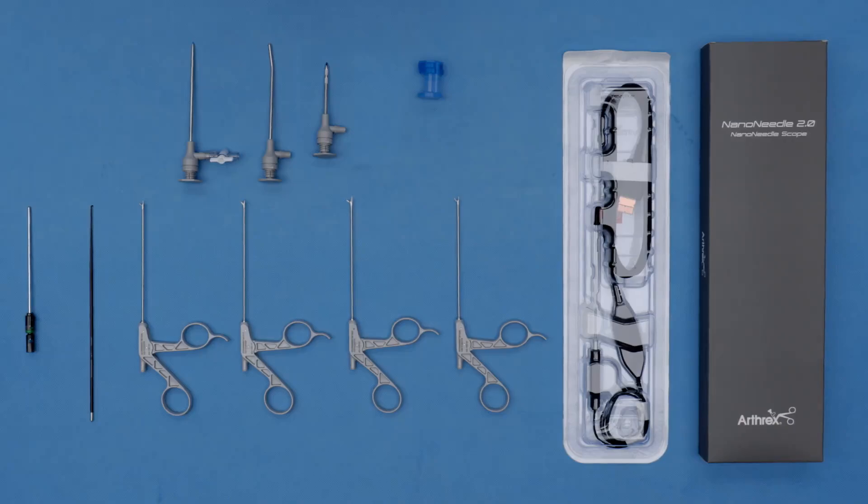Hello, I'm Abby Campbell from New York, New York. I'm going to be talking about the Nano Needle 2.0 camera system, as well as going through the new instruments that we have available and going through a basic diagnostic knee scope with all of this.